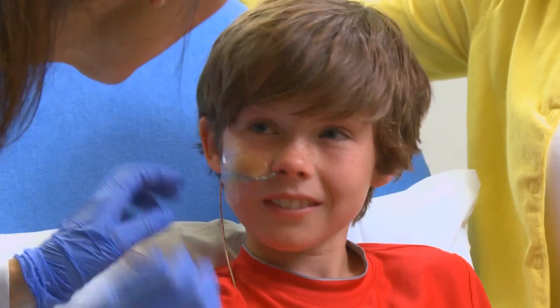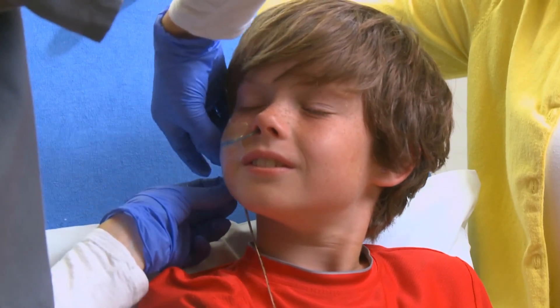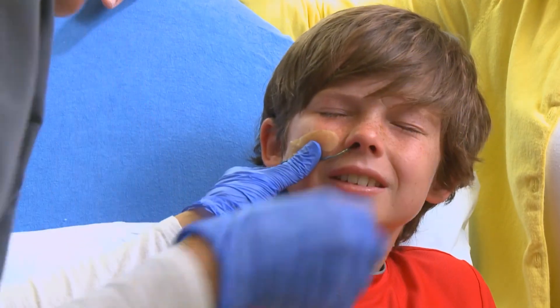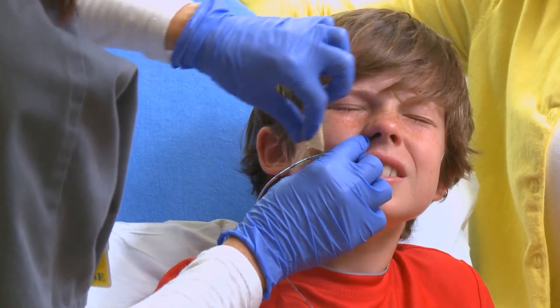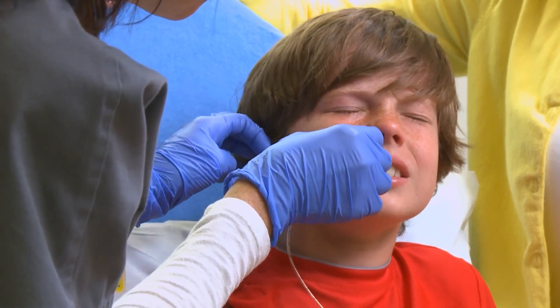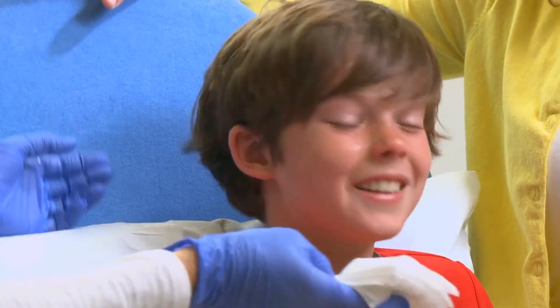Now we're going to take it out. First thing I'm going to do is remove the tape — just like a bandage coming off. You may sneeze sometimes when it comes out too. I'm going to take the tape off and on the count of three, I'm going to pull it out. One, two, three. It's out. Good job. Great job!